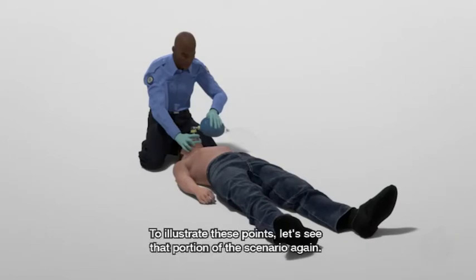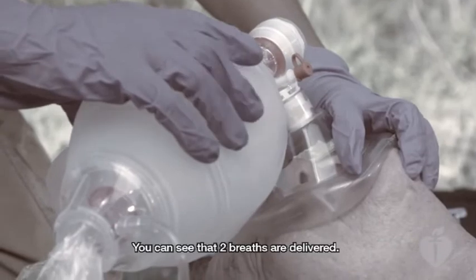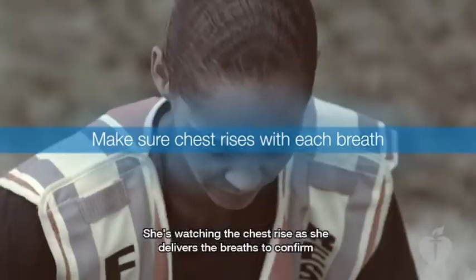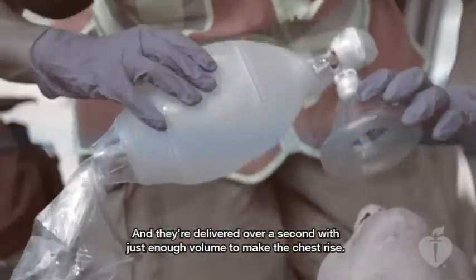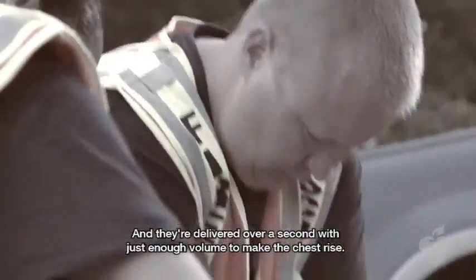To illustrate these points, let's see that portion of the scenario again. You can see that 2 breaths are delivered. She's watching the chest rise as she delivers the breaths to confirm that they're effective, and they're delivered over 1 second with just enough volume to make the chest rise.